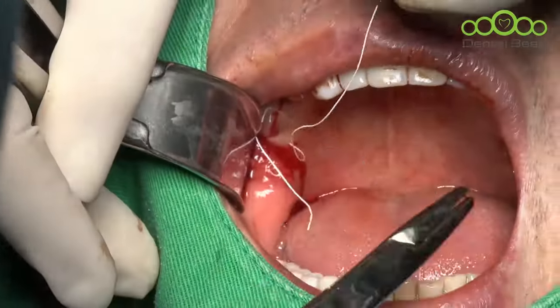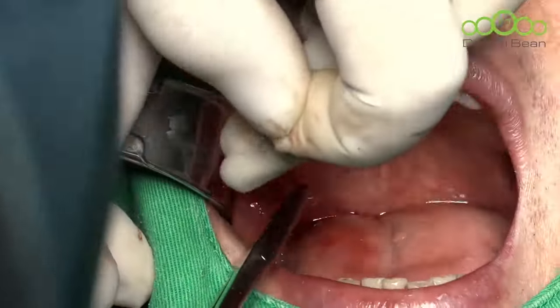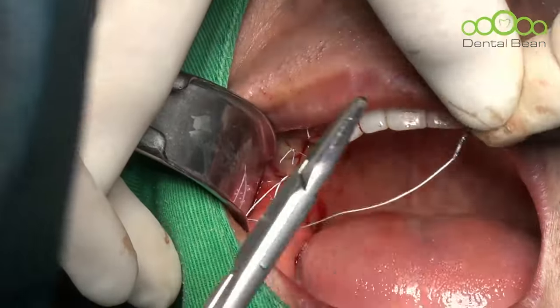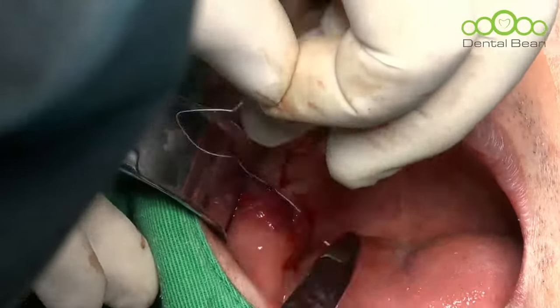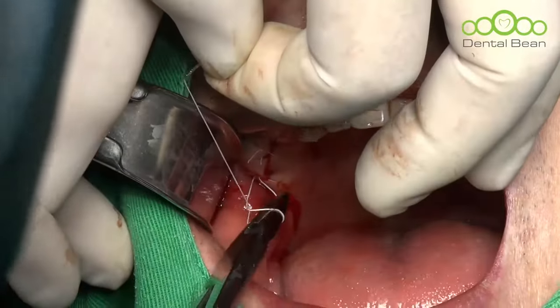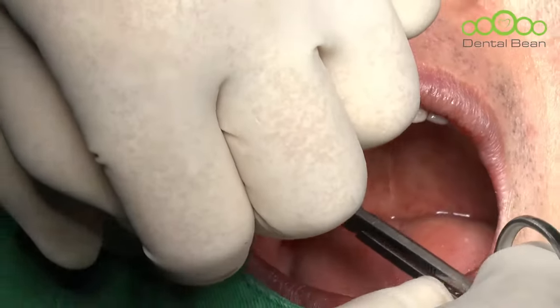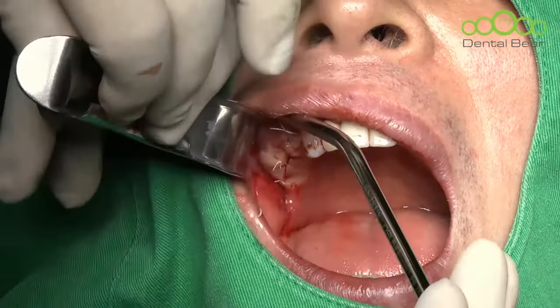Usually, I always have to use a final drill. Final depth will be controlled by the drill, not by the chisel. So, no need for exact depth control during chiseling. Just focus on separating the ridge. Okay? And final depth will be controlled by the drill, not by the chisel. I think it's enough.